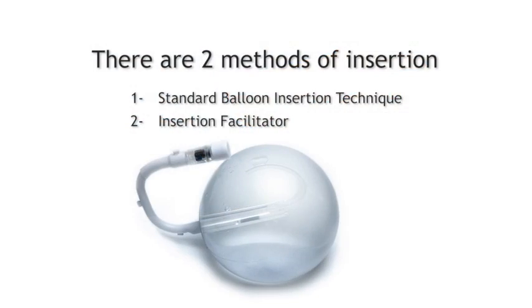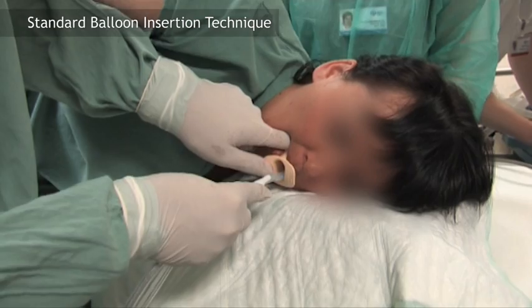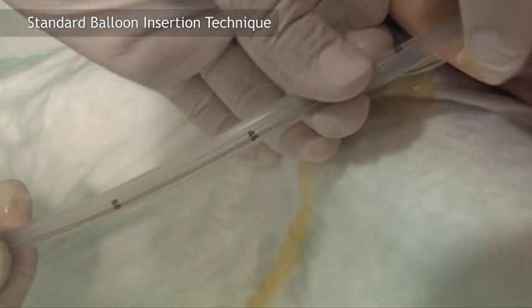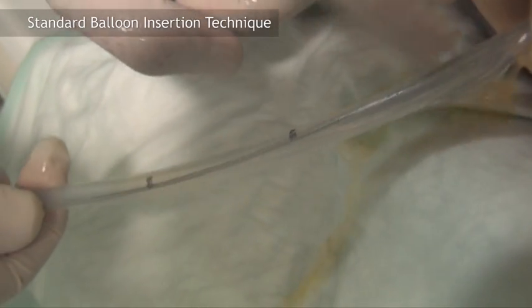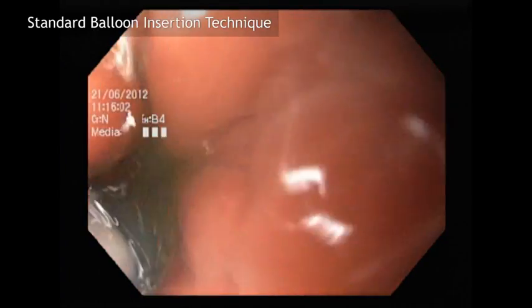There are two methods of insertion. For the standard method, the device is lubricated and the balloon is passed to the oropharynx and the patient is asked to swallow. Advance until the level of the gastroesophageal junction. Insert the endoscope and advance to the stomach.